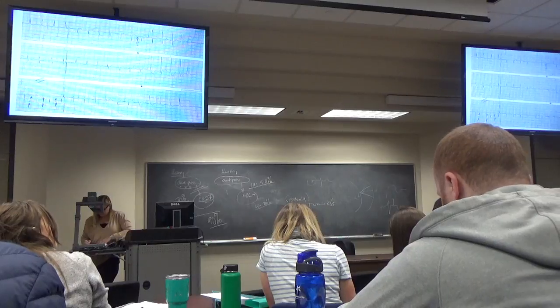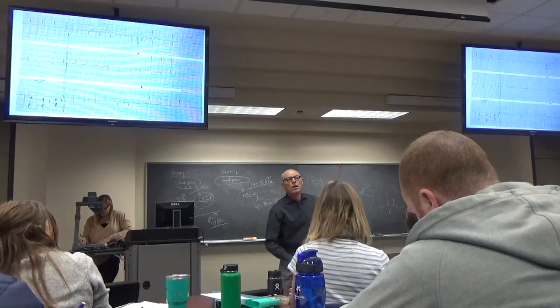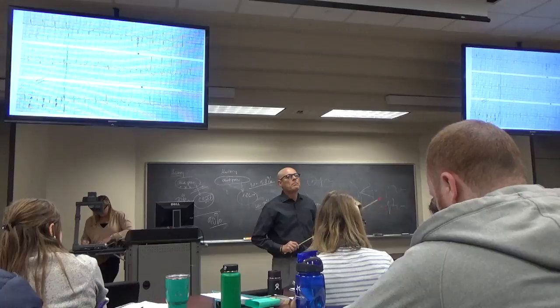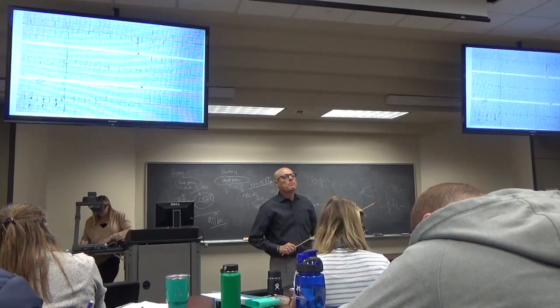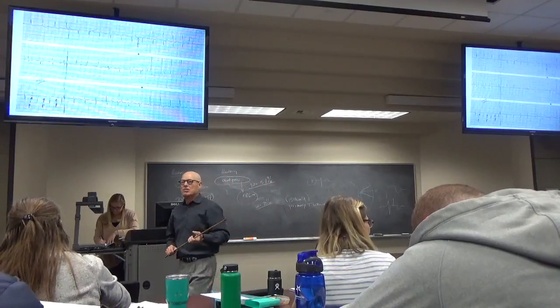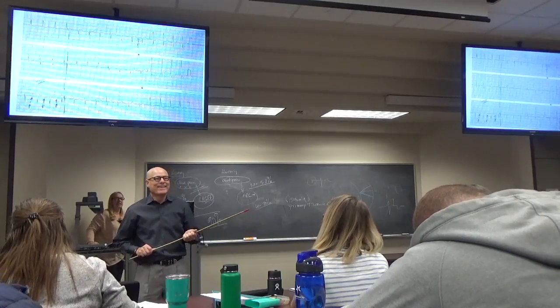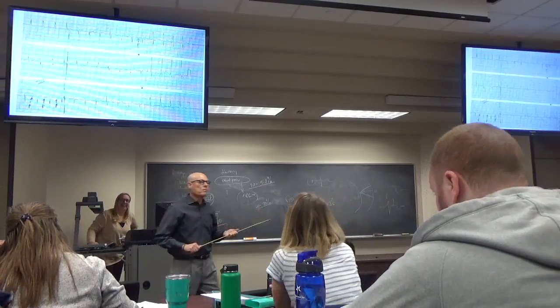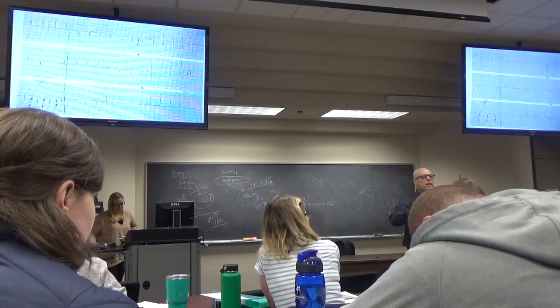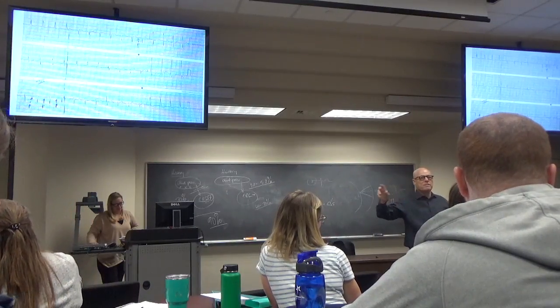Questions? You may have said this, but every time there's an inverted P wave, does that give you points for the LVH in lead one? Lead V1? I mean, yes. No, lead one. We're just looking at lead one, right? What is the bias embedded in that question? Do you remember the question? You may have said this before, but if every time you have an inverted P wave in V1, is that better?